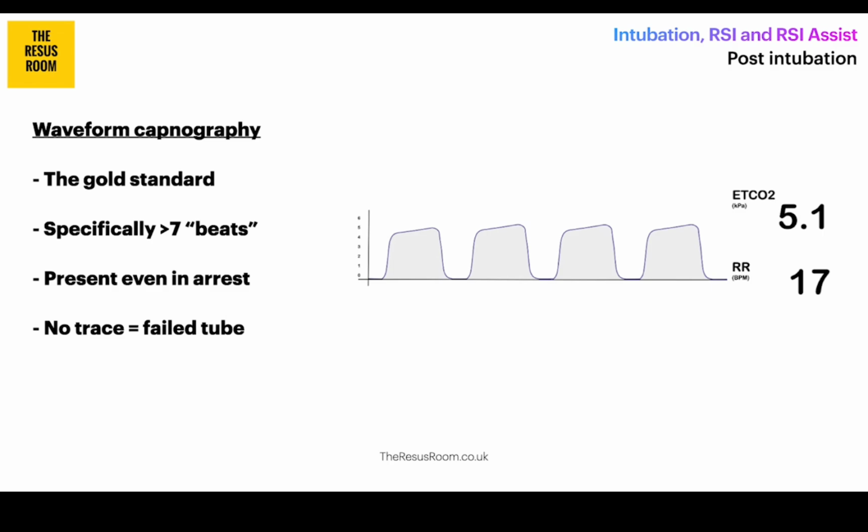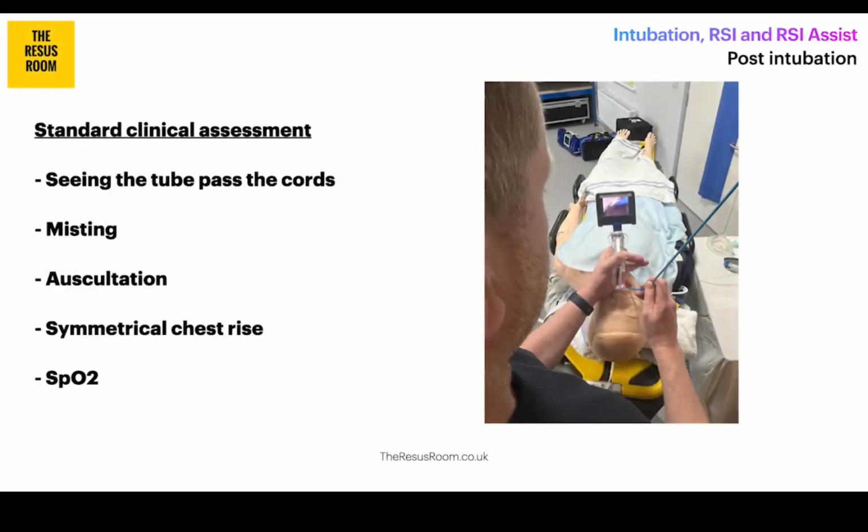Now, if that isn't there, the absence of a recognisable waveform indicates failed intubation, unless proven otherwise. That's a key bit, and so often this is the element that has been misinterpreted in these cases. Put simply, no trace, it is a failed tube. And this is true even in cardiac arrest. The waveform might be a bit smaller, but crucially it will still be present to some degree. So sorry to hammer this home, but for intubation, alive or in cardiac arrest, you need to be seeing some reliable end-tidal CO2 trace.